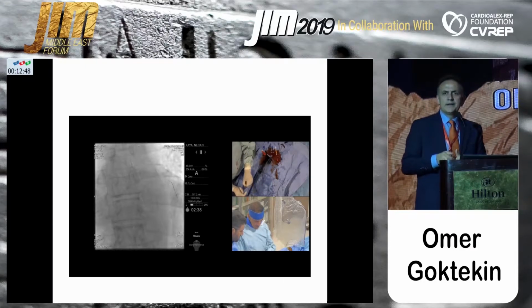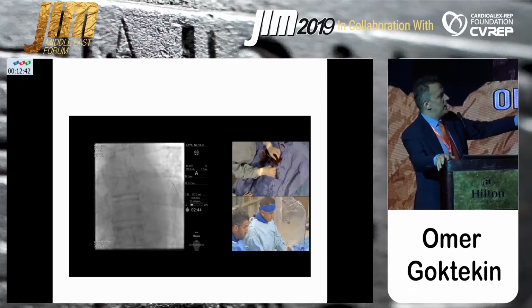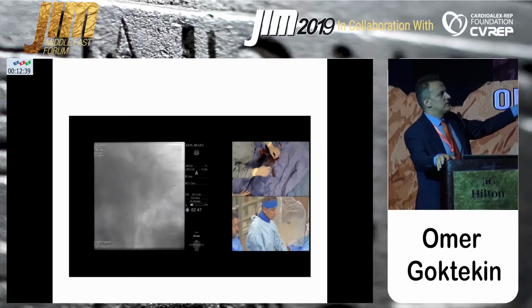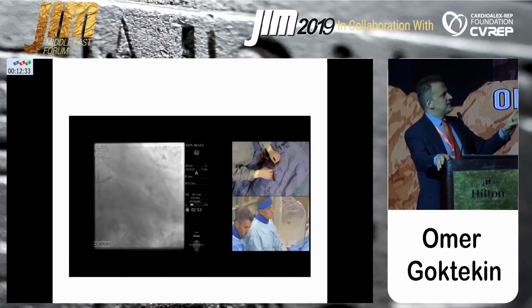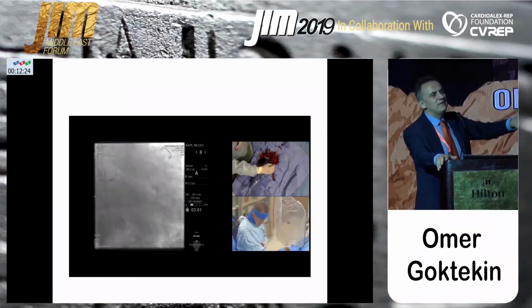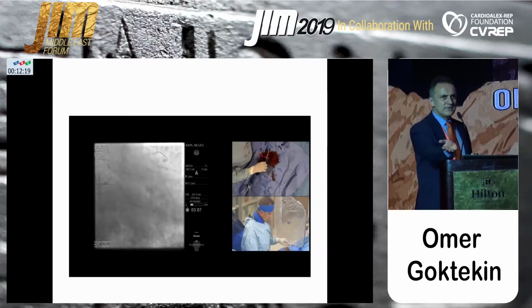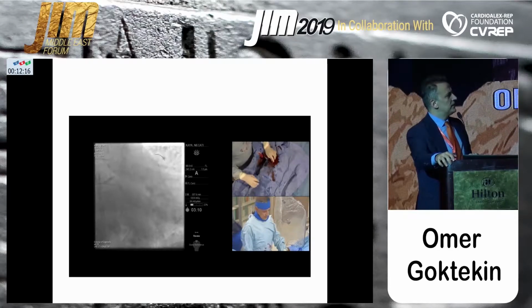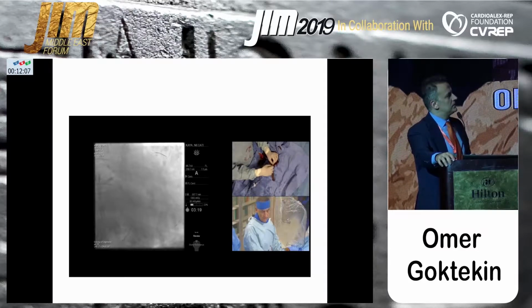So we give some pressure with the indeflator device, and actually the microcatheter comes back by itself. Very easy. And after that, I sent a 2.0 balloon. It was a Mini Trek, but a good balloon will cross this. And you see how easily it crossed. This is a 2.0 balloon, crossed easily, and I did some dilatation. It starts from the distal because it's a 2.0 balloon. I don't think it harms the distal because OM is not a small vessel. We do several dilatations.